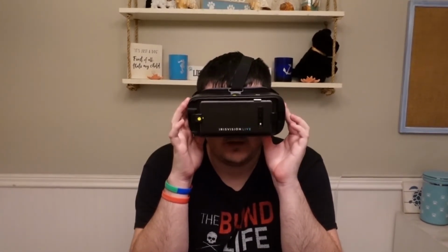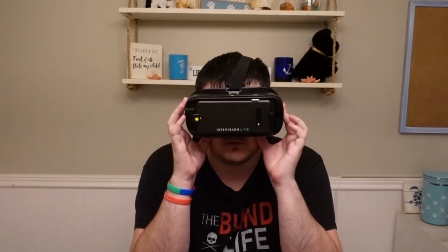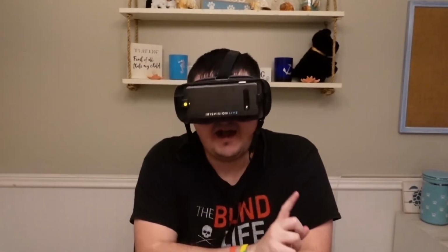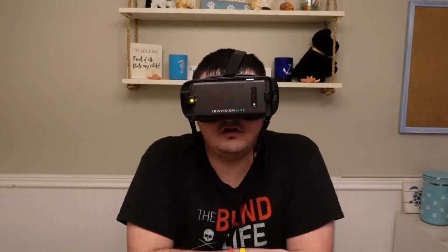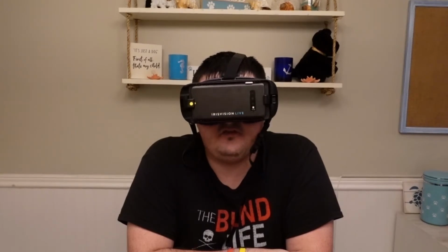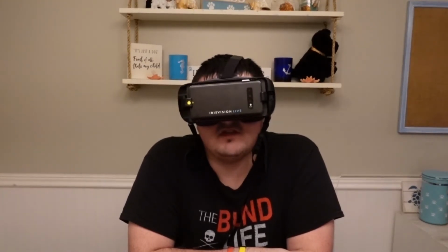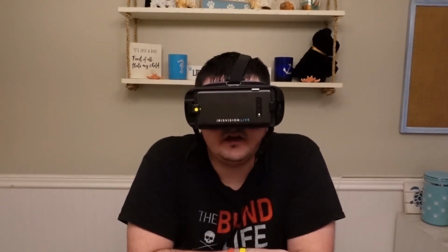So now, let's talk a little bit about what I think about this. Of course, I'd love to get my sister's thoughts when I can. For me, one, it kind of sucks that you can't move. And by move, I mean walk using this. It suggests that you sit while you're using this, and definitely do not drive. Again, I don't know why you would be driving if you needed this. You probably can't drive if you need this, but you can't walk while using this.